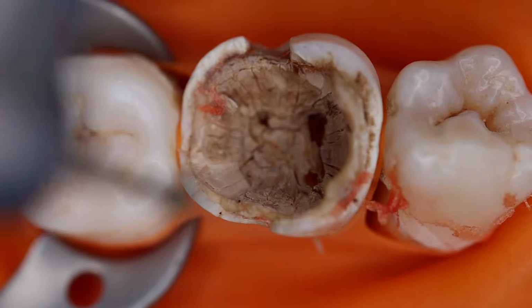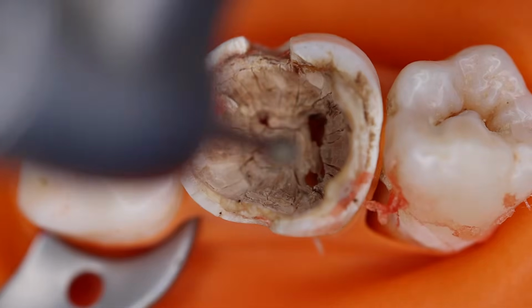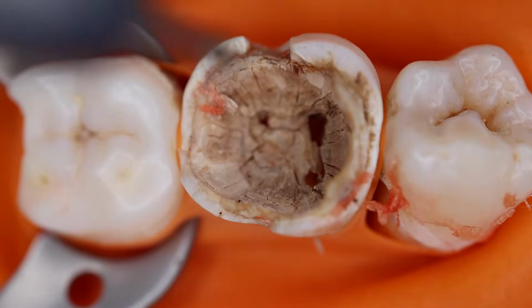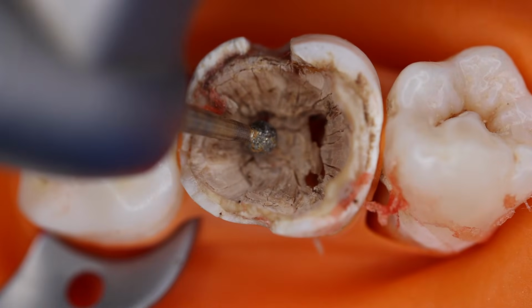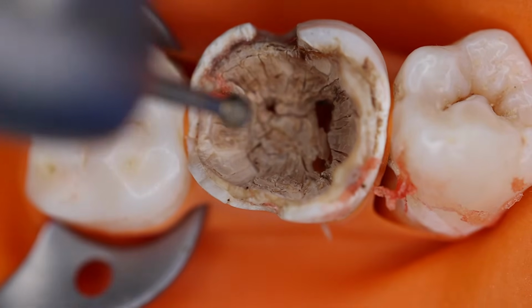Now when planning the access cavity preparation, we go slowly, conserve the healthy tooth structure, remove the caries that is there, and identify the orifices, as many orifices as we can. So beginning step by step, we have this round diamond point and we are going to get into the access. So let us proceed.